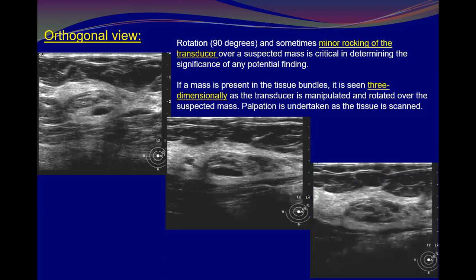So start to see, and here more. More obvious, yes, there is a lesion. There is a probably benign lesion, which was fibrocystic changes. Okay. Within the breast, yeah, like a hamartoma, or fibrocystic changes sometimes. It came like this, and hamartoma or fibroadenolipoma also has the same appearance.